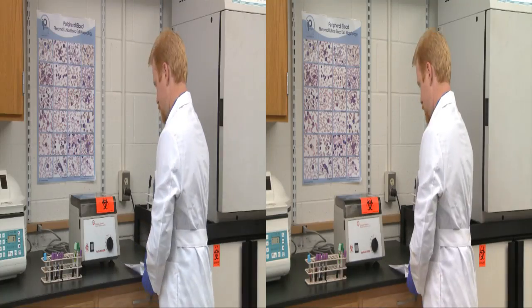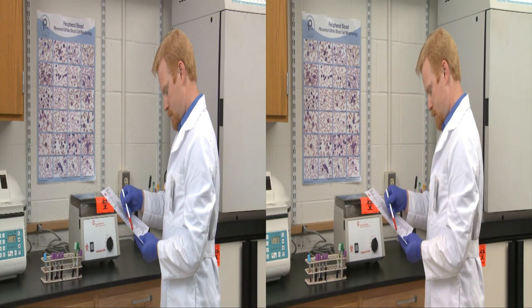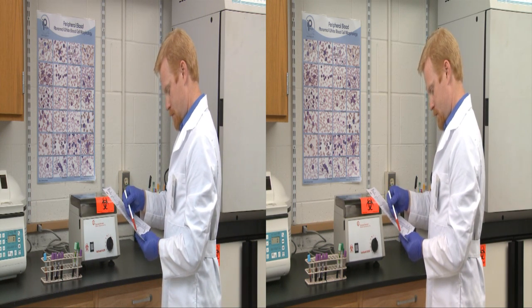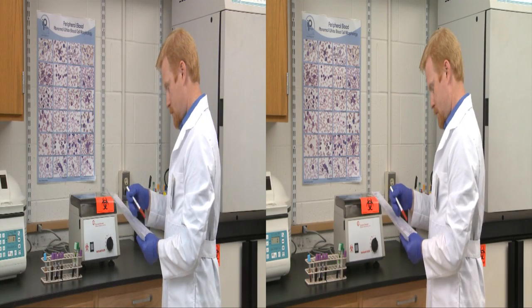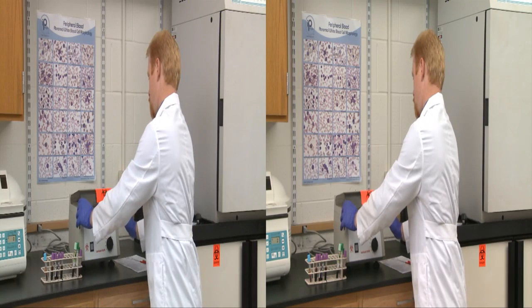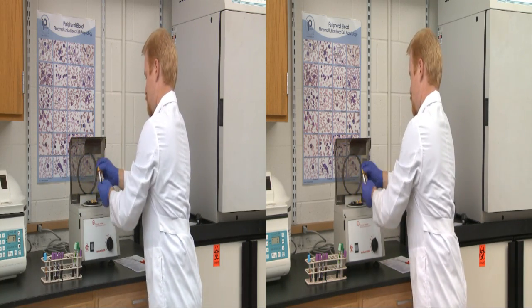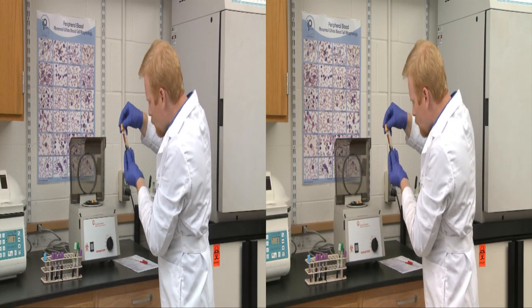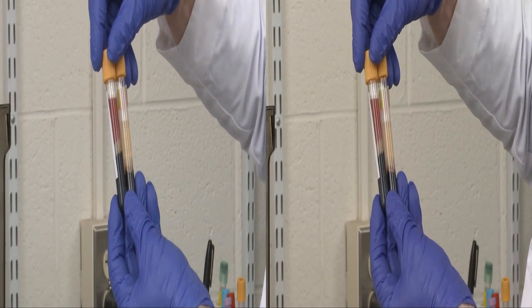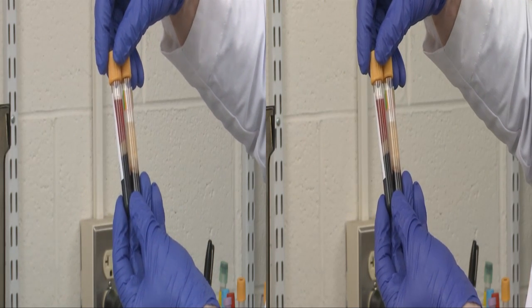While it appeared to the healthcare professional that this blood draw was successful, it's clear once the sample is centrifuged that the choice of needle gauge was a poor one. The selection compromised the integrity of the sample. Aside from these two examples of invisible errors, there are many visible signs that a healthcare professional may not be following standard precautions that ensure a quality blood draw as well as a satisfactory customer experience.